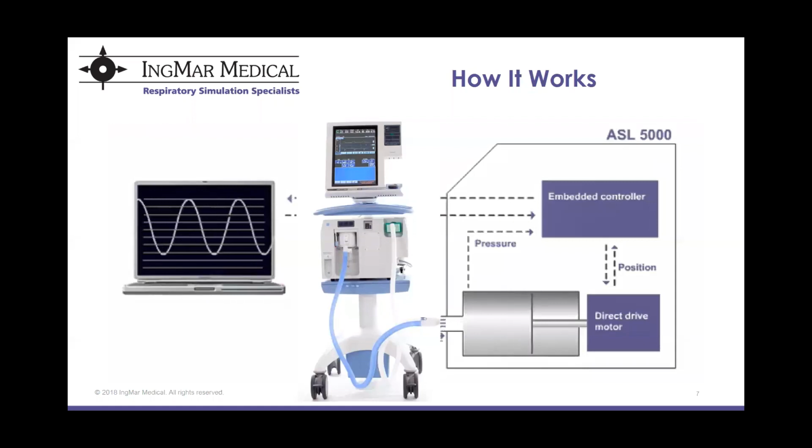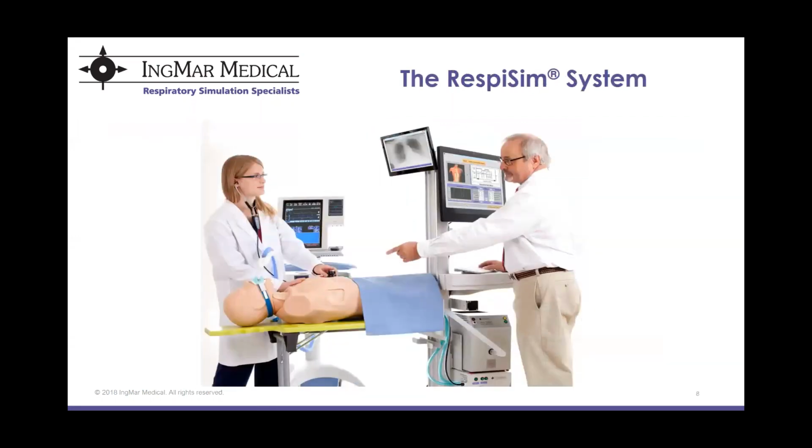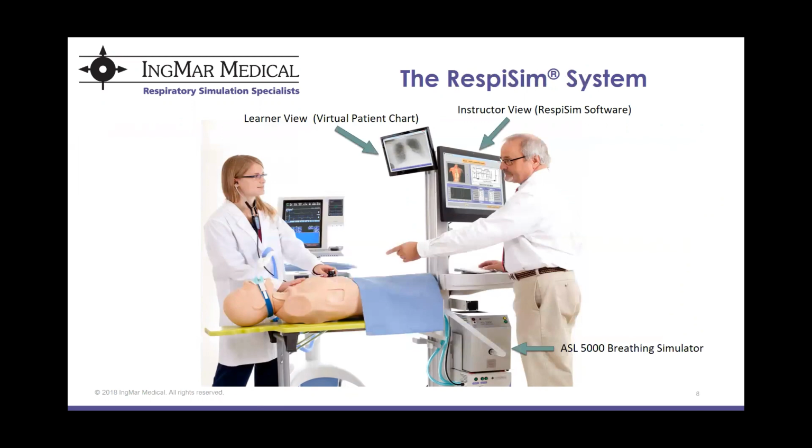But we do have options available for integrating a mannequin with the ASL 5000 to create a more realistic learning environment. Here you see an image of our most comprehensive solution, the RespiSim Pro package. Still driven by the breaths created from the ASL 5000, this system includes several items to enhance the experience for the learner, such as our RespiPatient mannequin, a separate monitor for viewing patient information such as x-rays and vital signs, and a simulated stethoscope for auscultation.